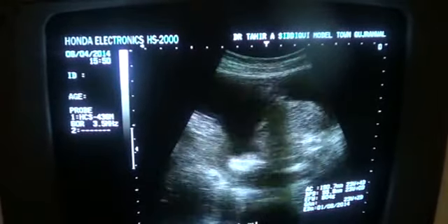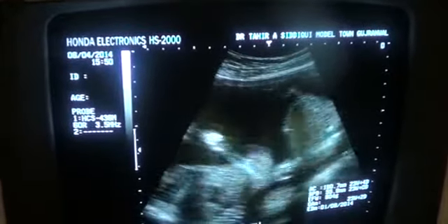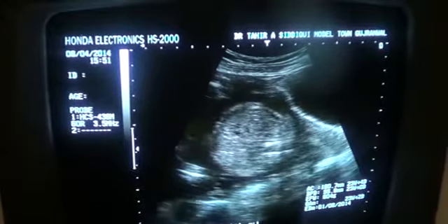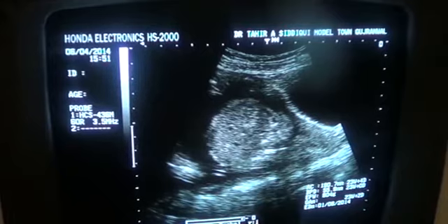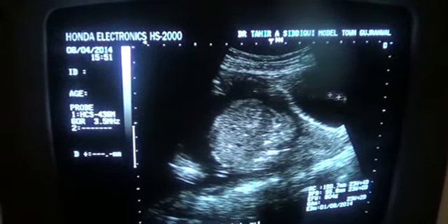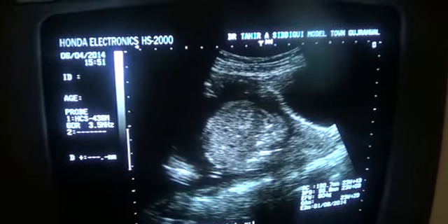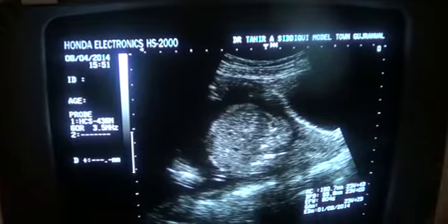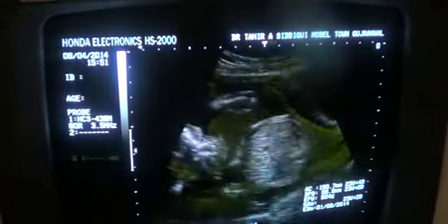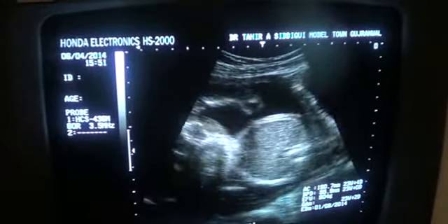Now this is the fetal body in transverse section, and this is fetus number 1. Why? Because this is the one that is close to the cervical canal. We label it this way: this is the urinary bladder, this is the cervix, closed os, and this is the body of the fetus. So the fetus that will be closer to the os, the cervix, we will label as fetus number 1.